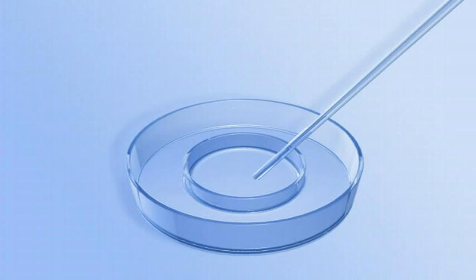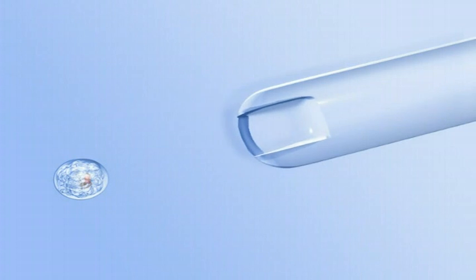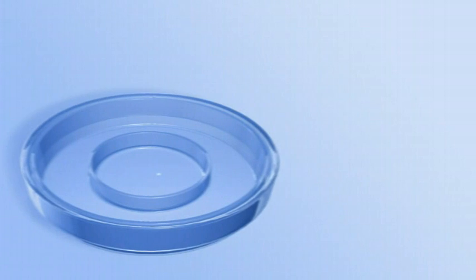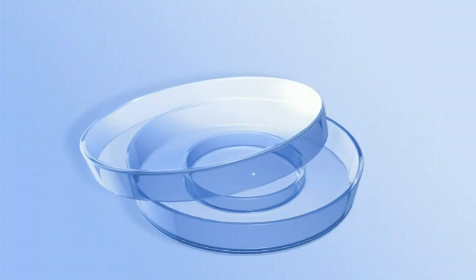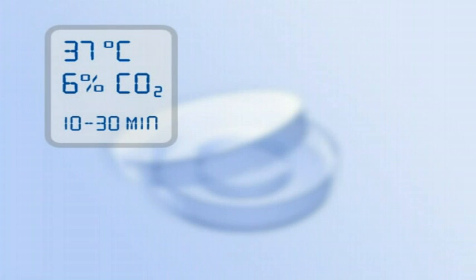After pre-equilibration, transfer the embryos to embryo glue. Equilibrate the embryos in embryo glue at 37 degrees Celsius and 6 percent carbon dioxide for 10 to 30 minutes.